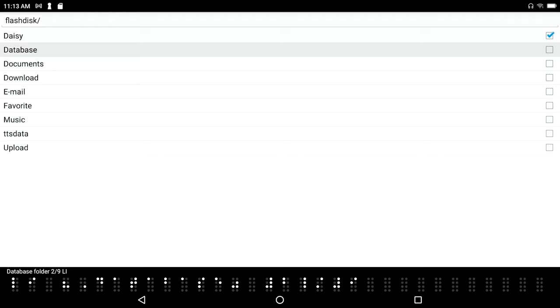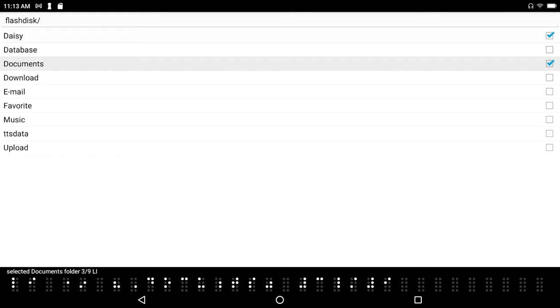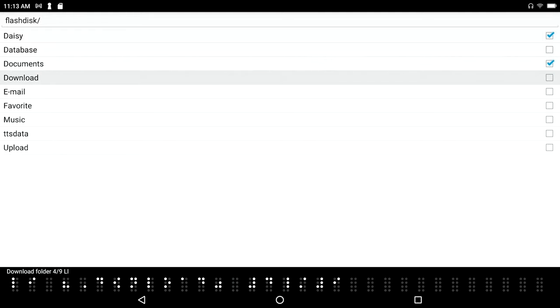But that's okay because at this point I don't care about that stuff. Documents folder 3 of 9 list item, I do care about my documents, and that's by default where all my notepad and word processor documents live. Selected documents folder 3 of 9. Download folder 4 of 9, and I might care about my downloads too, so I'm going to press space on that.